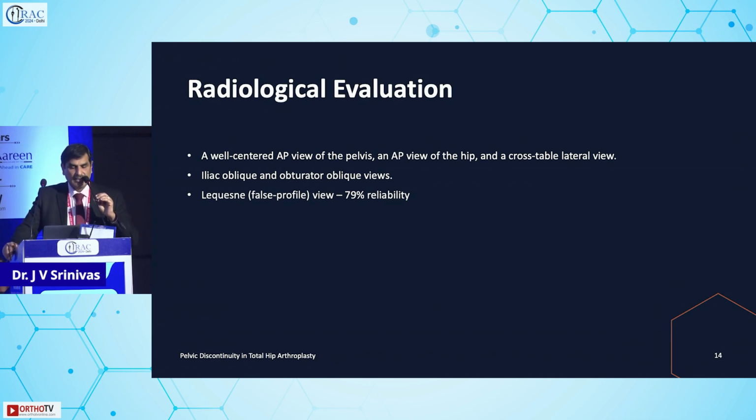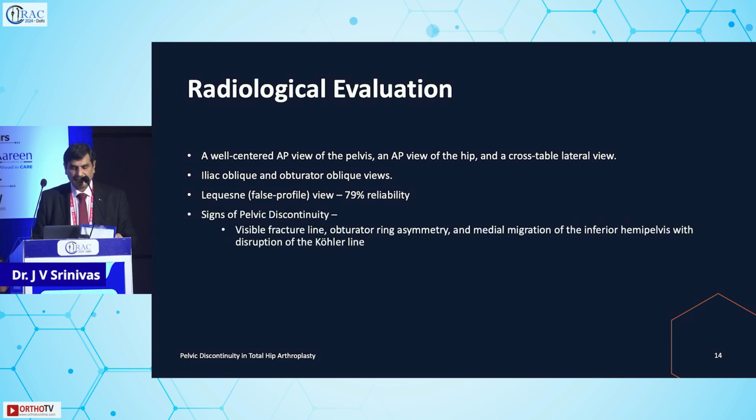Judet view is the one which can diagnose if you're already having an implant, a cup in place, where you're not able to diagnose your pelvic discontinuity. This view is good. I'll tell about that.